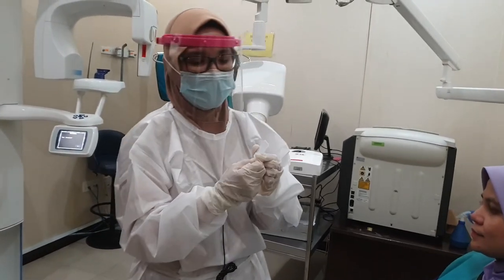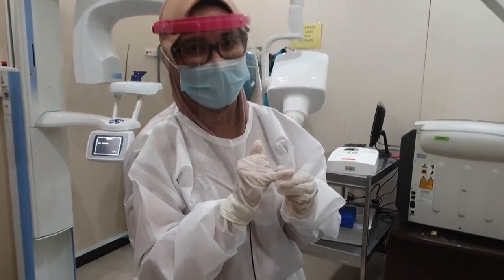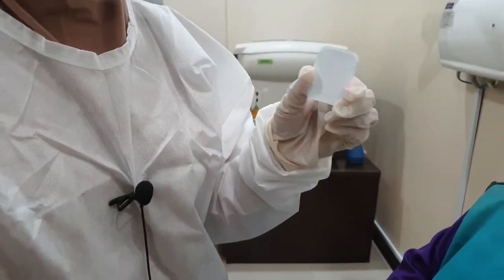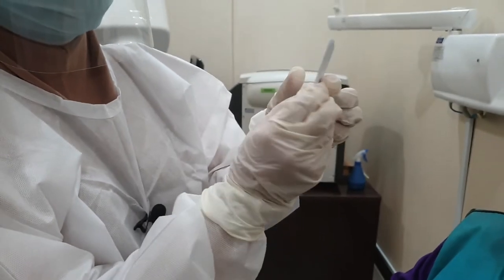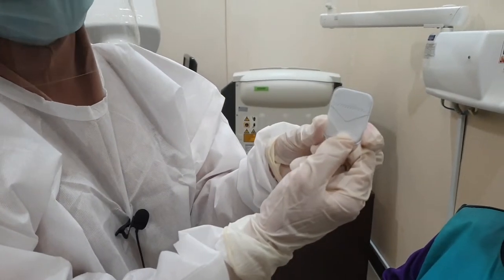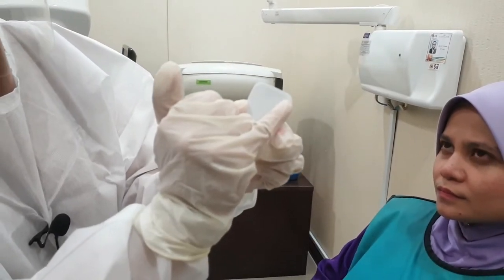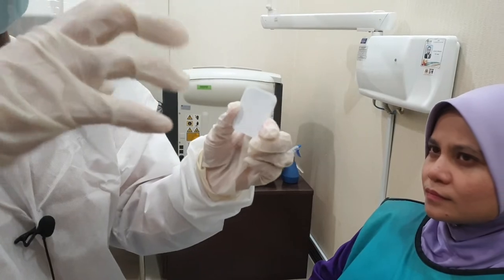Remember, the same principle applies: the raised dot must be facing the X-ray tube. If you place it the other way, it is wrong and you will get an error on the film. So the raised dot must be facing the X-ray tube.